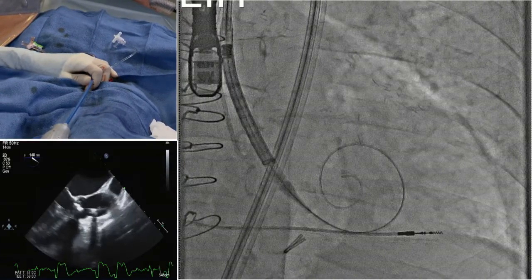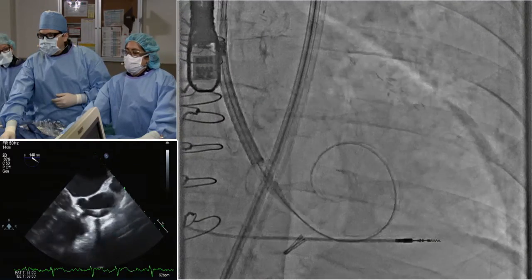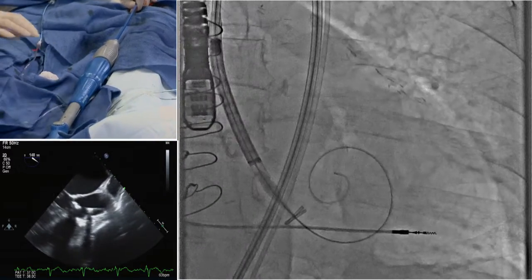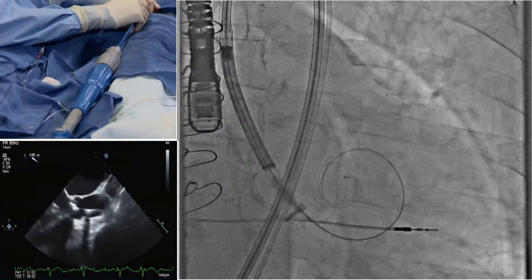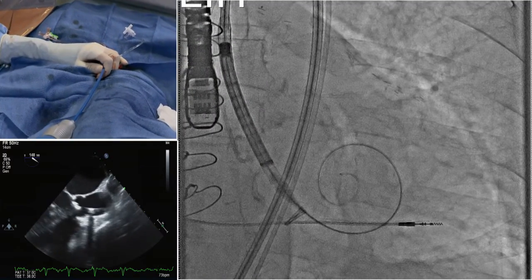Of course, without seeing the CT scan, and again the absence of intramural thrombus, it's a bit difficult. I agree. I guess the only question you might have is, why not use the inline sheath? You use the Solo Path, but if you're not pre-dilating, then why not just use the inline sheath?